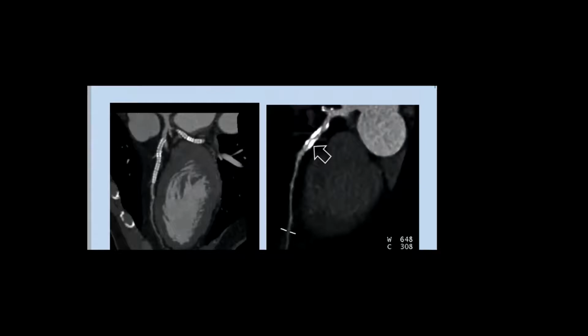What is this? The one on the left. It's a cardiac CT showing dense calcium. Calcium. Yes. Which one? Are you talking about the one on the left or the right? On my right, the one with the arrow. Exactly. That is calcium. I agree with you.